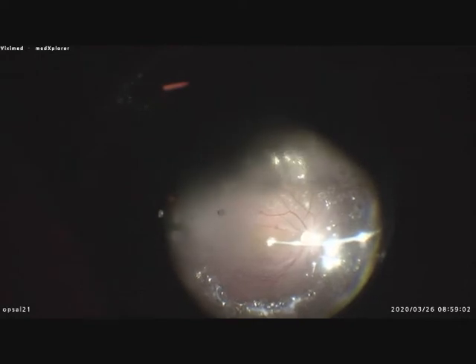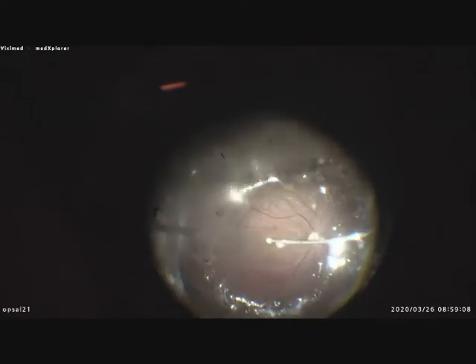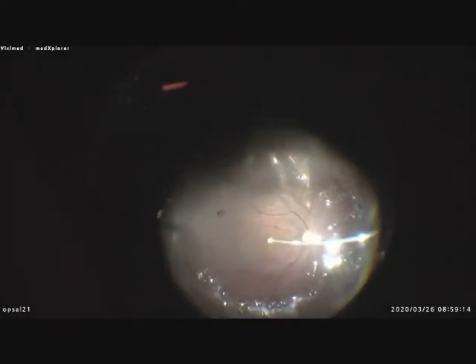The hole looks closed now, so I wait one to two minutes — and the hole opens again. So I repeat the manoeuvre: retinal massage and aspiration of fluid.